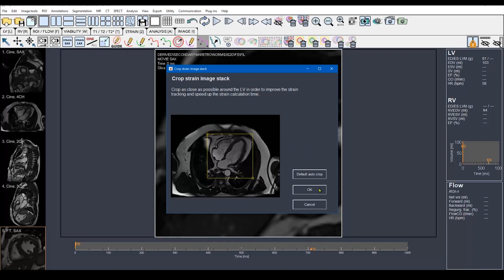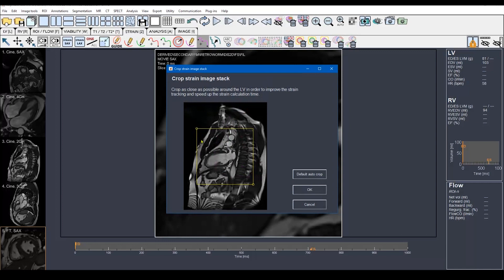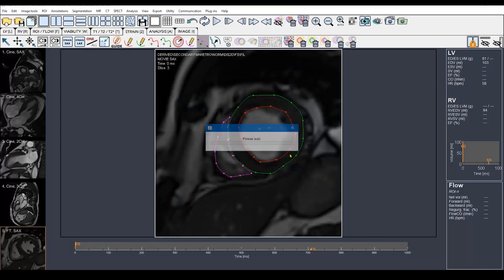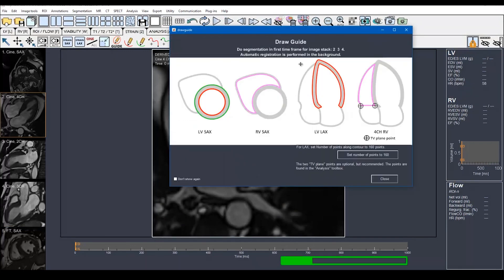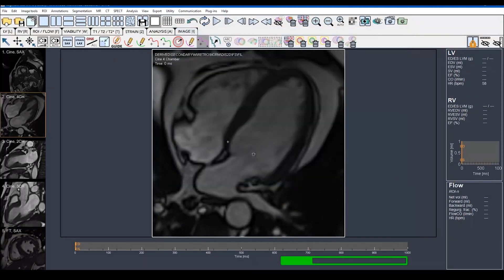I will select this icon and it will show me the crop box. With the same principles as described in the short axis, I will adjust it — this is for the four chamber, and for the two chamber, and for the three chamber. This is a drawing guide which I'm going to ignore. I'm now ready to draw the endocontours and epicontours in the long axis. The main difference from the short axis is that we draw both the endocontours and epicontours with the same red color — we don't use the green color for the epicontour.